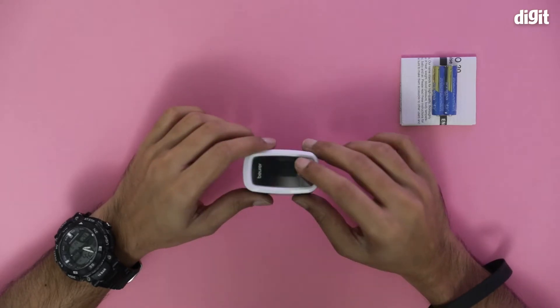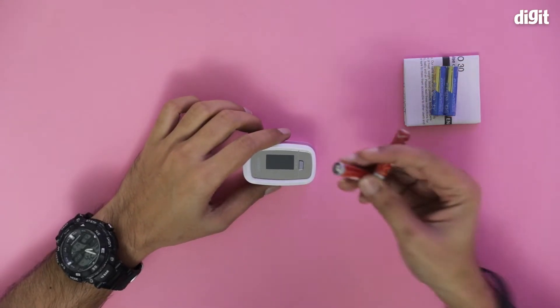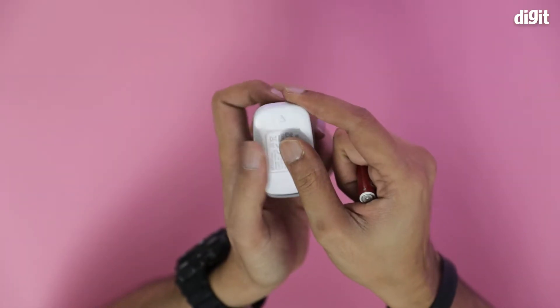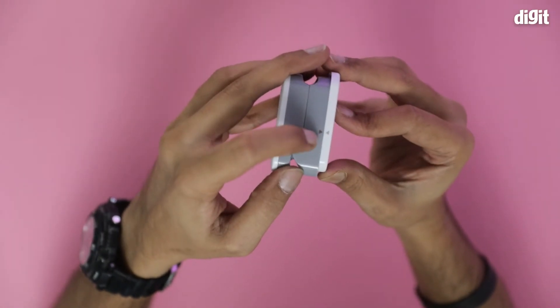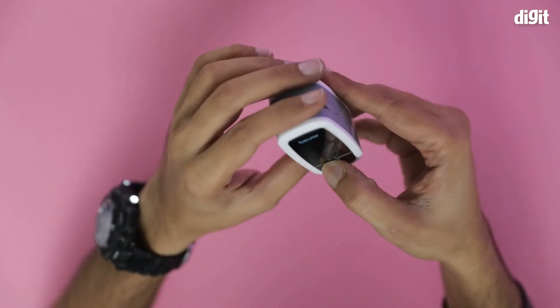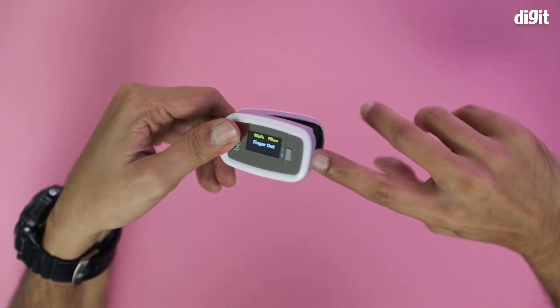I'm not going to use the included batteries since they're so neatly packed, but I do have a pair of triple-A batteries I'm going to use. I'll press the arrow button. These are the battery compartments — let's close them. There are markers that help you put the flap back in place. I'm going to turn it on — it's saying 'finger out,' so obviously I'm going to put a finger in and wait.